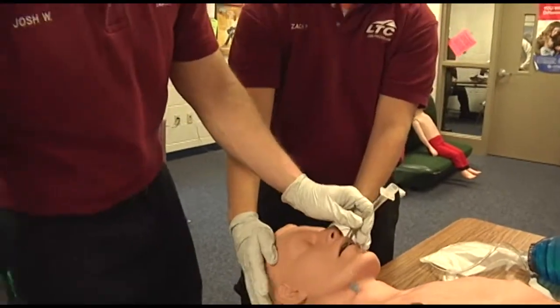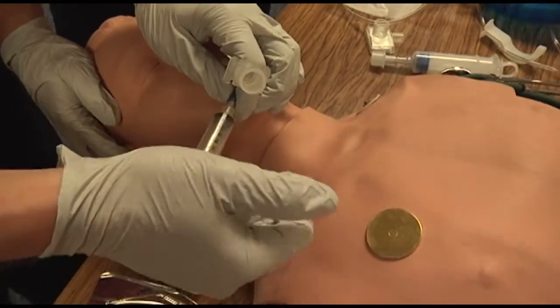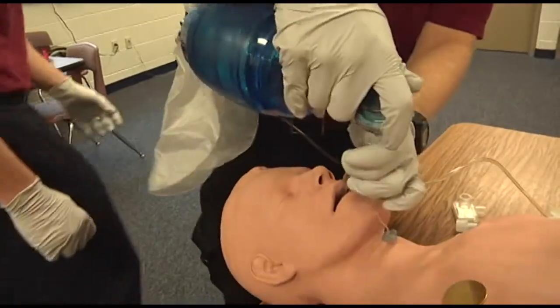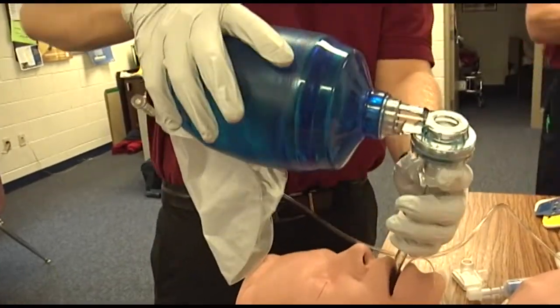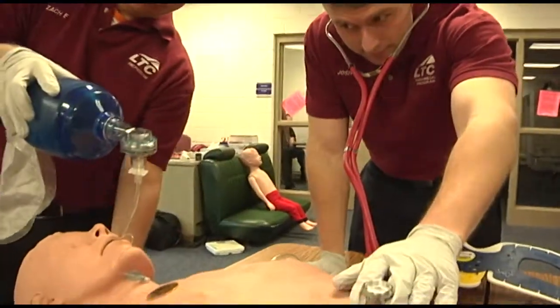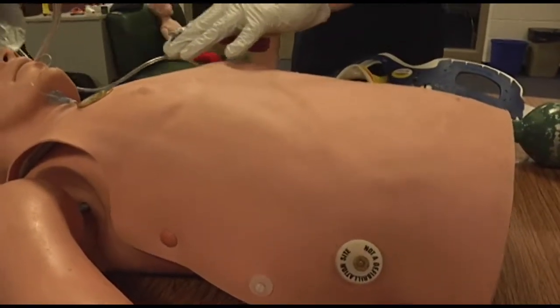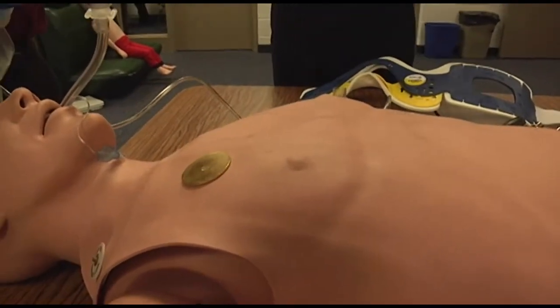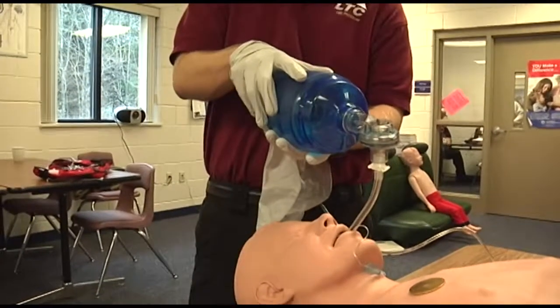Inflate the cuff to the proper pressure, then disconnect the syringe. Direct ventilation of the patient. Confirm proper placement by auscultation over the epigastrum, then auscultate bilaterally over each lung. You would expect no epigastric sounds and bilateral lung sounds to be present.